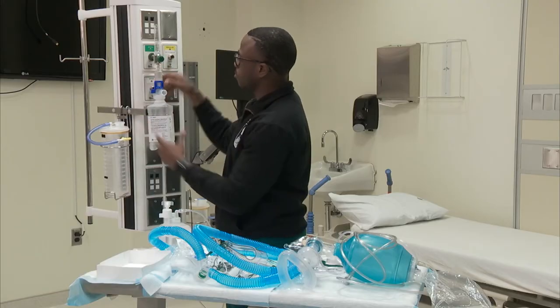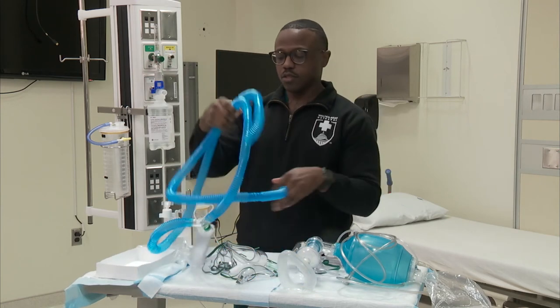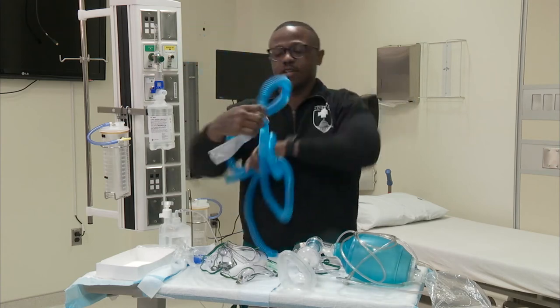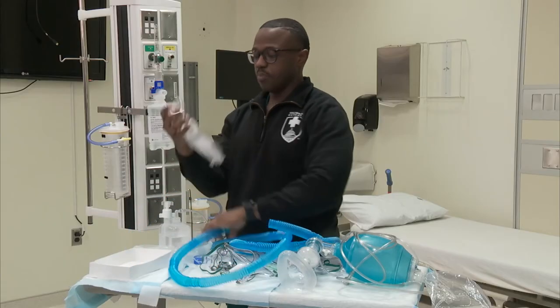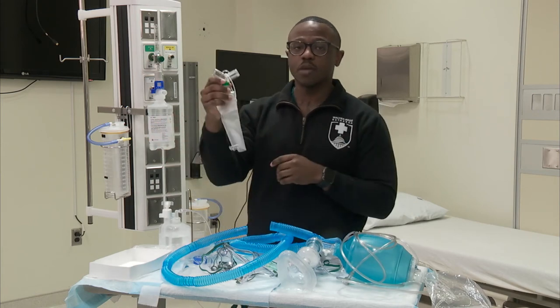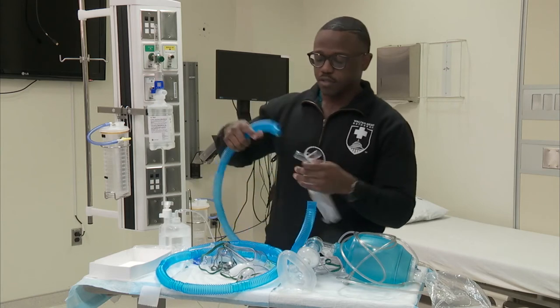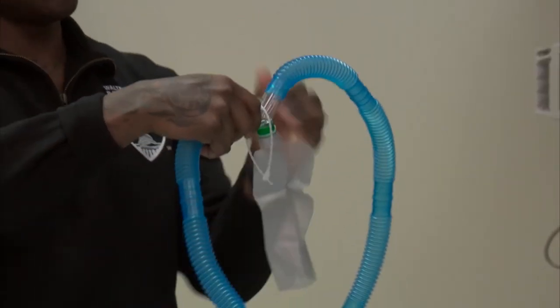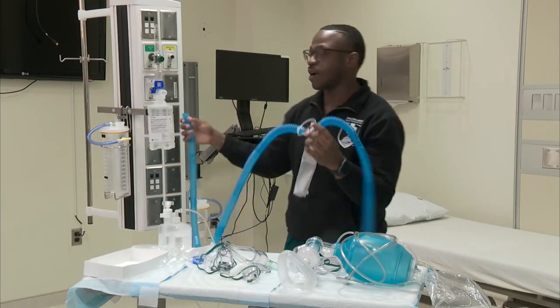I'm going to twist this knob to 30% and turn it to eight liters per minute. I have some corrugated tubing here — I pre-cut it and added a water trap. We take about 12 to 15 pieces of corrugated tubing, cut them in half, and put this water trap at the bottom because as the aerosol travels through the cold plastic tubing, it creates rain out. The water trap has a zip tie so you can secure it to the side of the patient's bed.